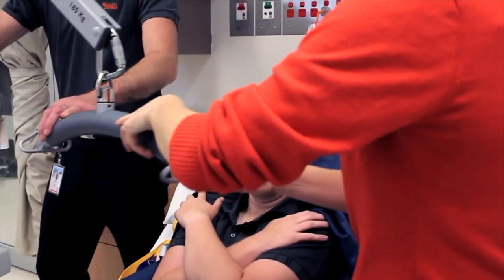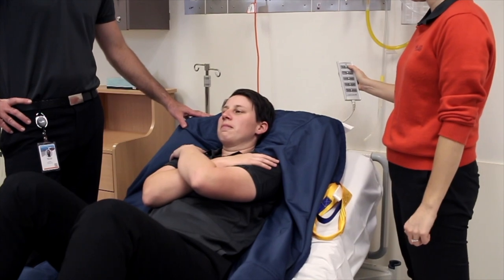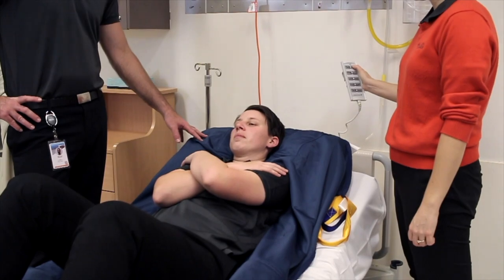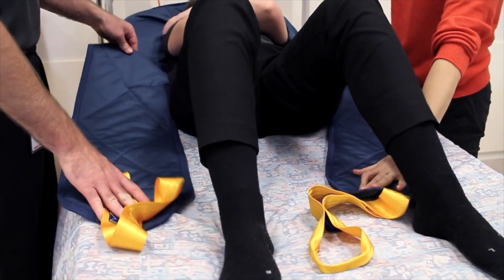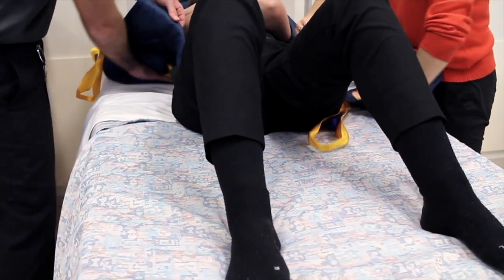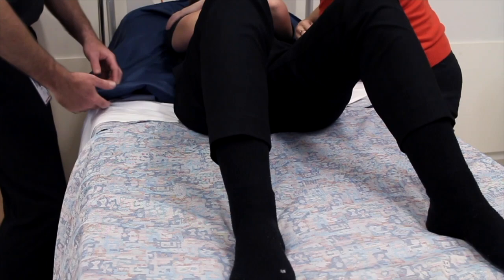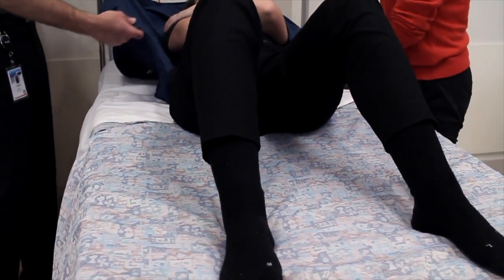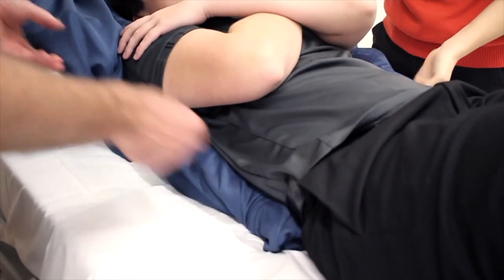To remove the sling we flatten out the bed and raise it to a good working height for each staff member, which is generally somewhere between the belly button and the upper thigh of both people. We'll then take the leg straps out of the road by tucking them under the body strap, and roll in any loose straps to minimise any risk of skin tears or catching of the straps on the client or consumer as we're removing the sling.